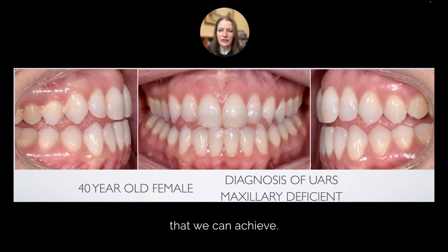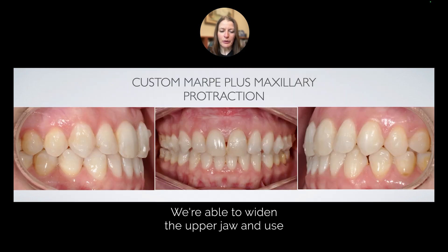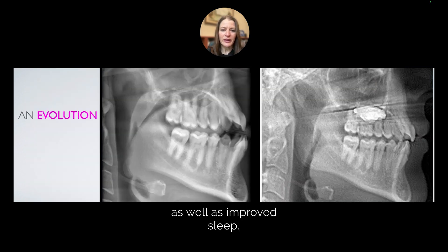Here's another adult female with a diagnosis of upper airway resistance syndrome, lack of tongue space, and maxillary deficiency. We're able to widen the upper jaw and use class 3 elastics along with aligners to customize her treatment plan, creating an improved bite, as well as improved sleep, less headaches, and overall facial balance.